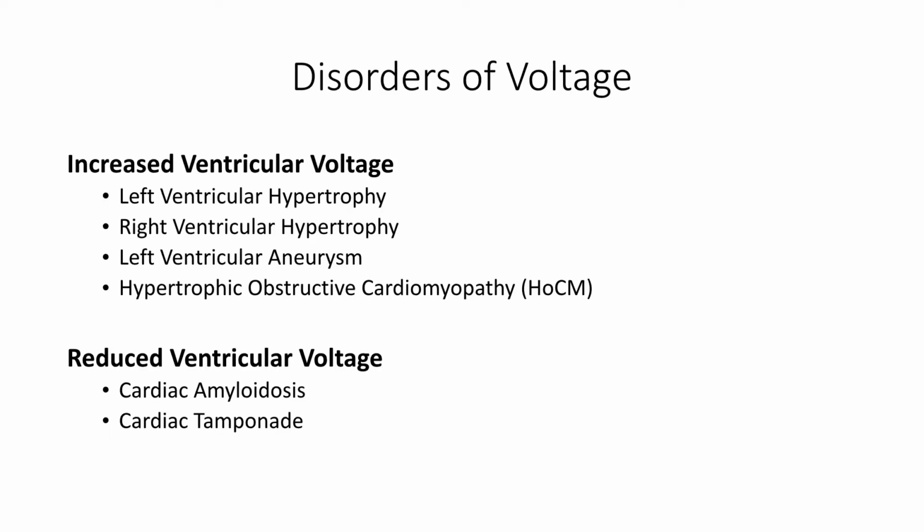Okay, so here's our next section on voltage. Our ability to sense the voltage from the heart tells us a lot about the thickness of heart walls. It tells us about the shape of the heart walls and the relationship between the heart and the chest cavity. Here's an outline of our section on voltage.